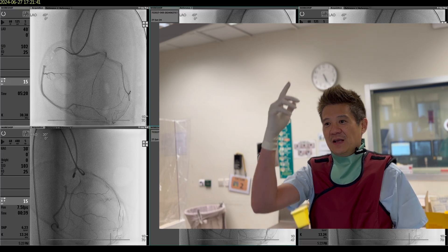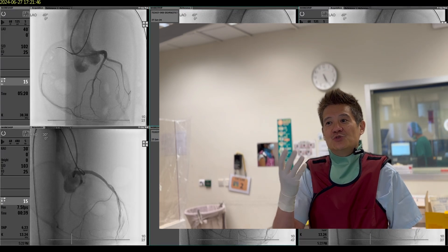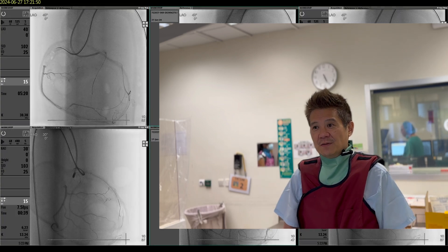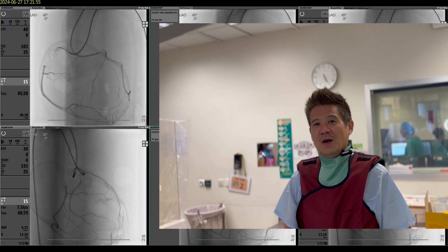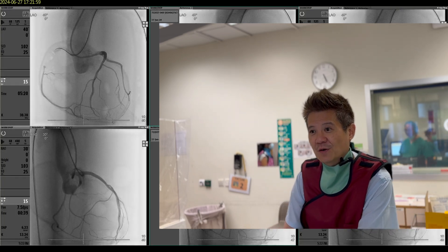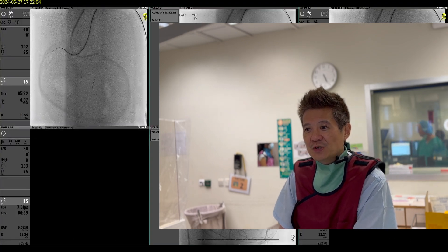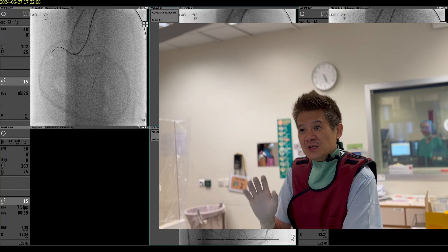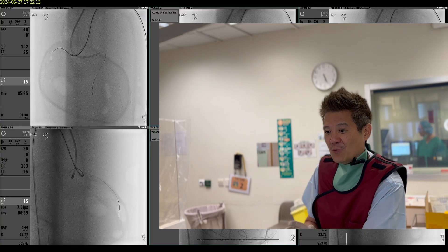Let's play the angio for people to see. This is the RCA CTO model — RCA in segment two of the right coronary artery. We have set up here a Corsair microcatheter with a Conquest 12-gram wire — Confianza 12-gram wire — with a one-millimeter 45-degree tip curve. We're going to wire this, starting by pushing the wire into the CTO body. Just like ADAPT wiring, we're going to use a CINE to document both views.